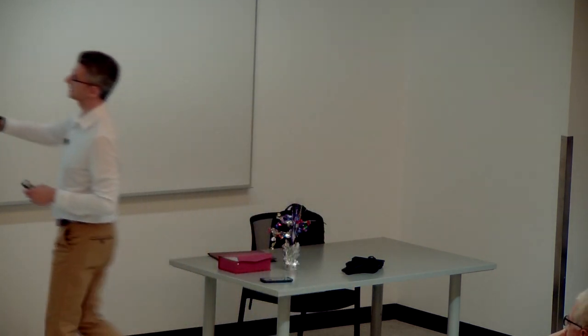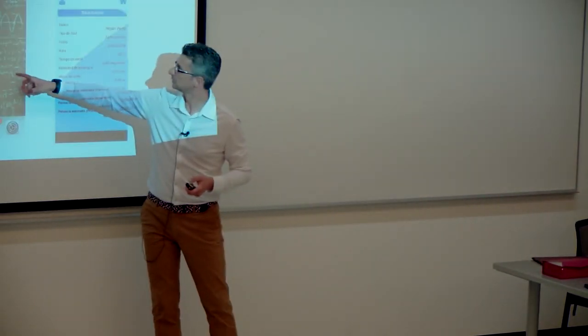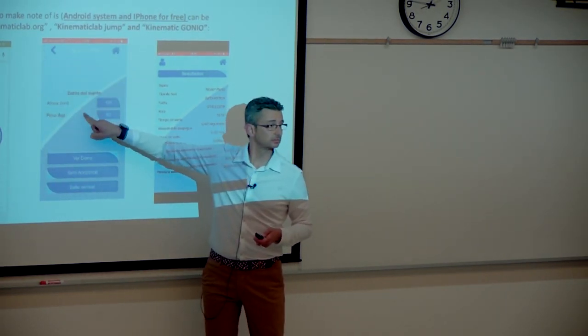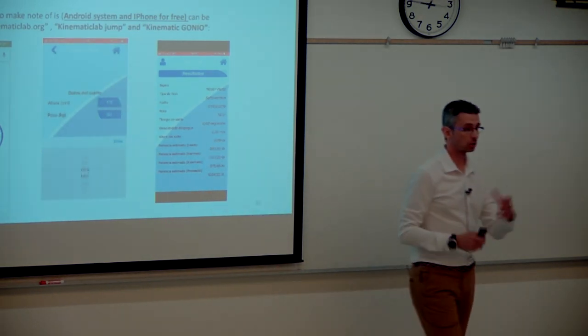The other question. I also wondered about a label, like this is patient number one or patient number two. Yeah, in this case, you have patient one, patient two, number of tests and the patient in the kinematic jump. In the goniometer app, on the mobile, you can put different patients with a number. And the other question was what? No, you already answered both of them. Thank you.